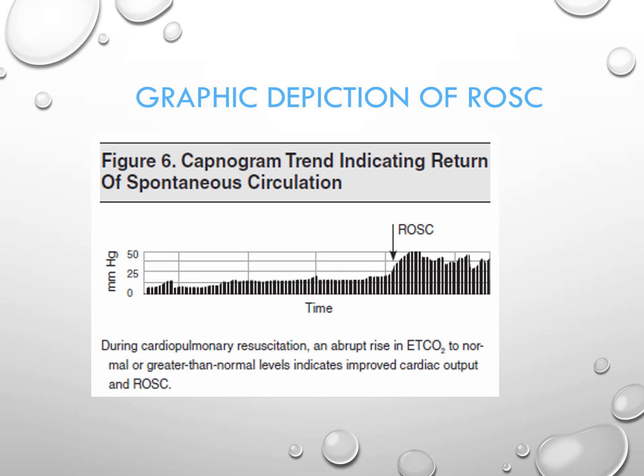There's gas exchange taking place, but if anything, the end-tidal CO2 is a little bit higher, and you could see it start to dip down a little bit towards the right end of this particular graphical depiction. Very useful information, end-tidal CO2 in a resuscitative effort.